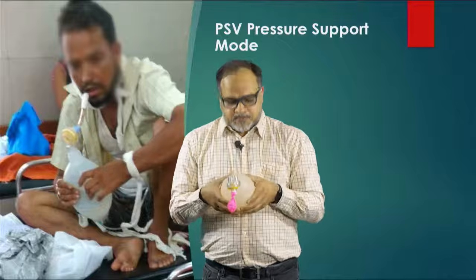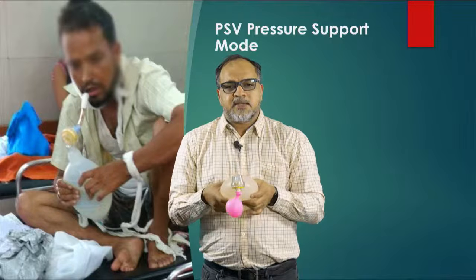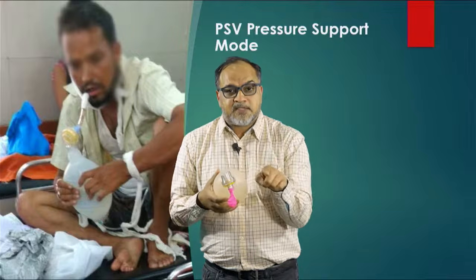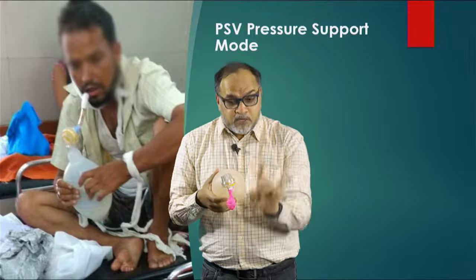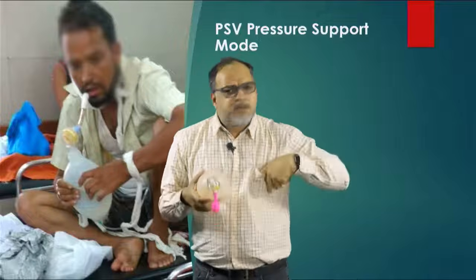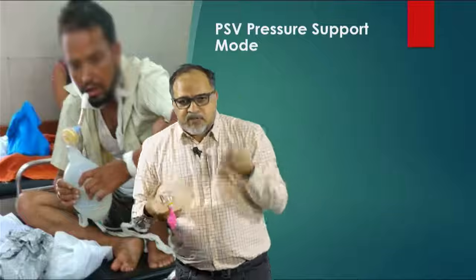2-3 seconds silence. The patient again triggers. The ventilator gives 15 centimeters of water pressure support, not a fixed tidal volume. It is just giving a support. What will happen? Everything will be fine. It's one of the best modes.